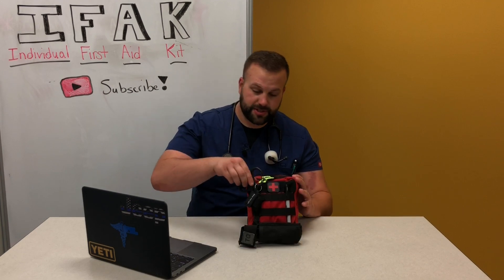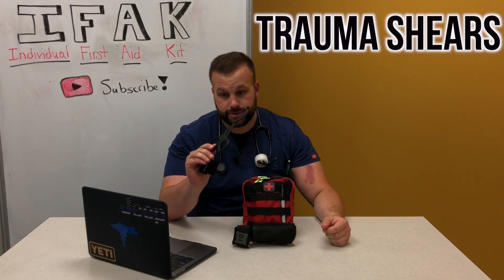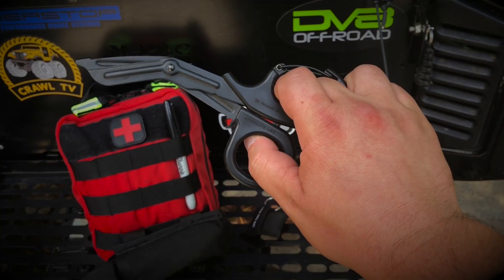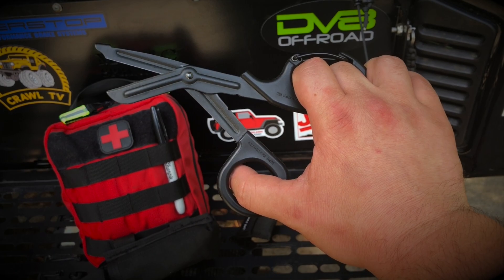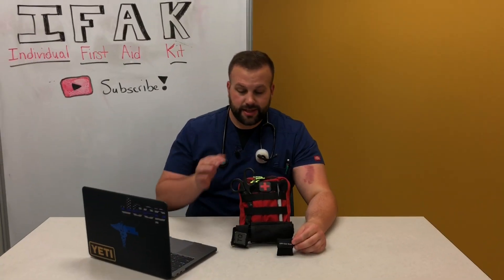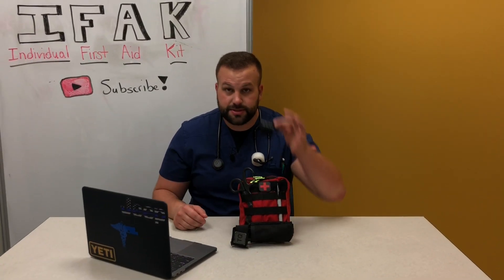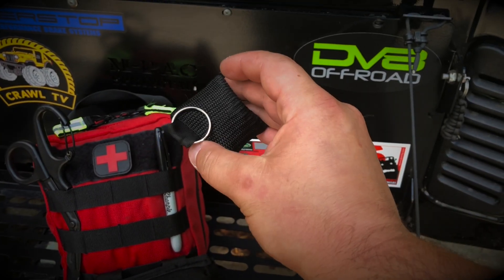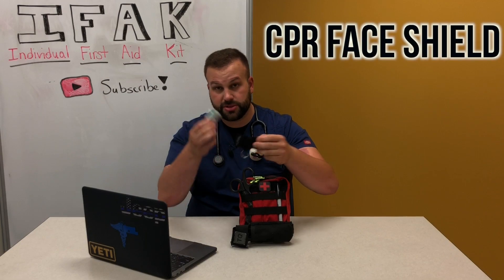The first item: a great pair of carabiner shears — very sharp, great size — with a carabiner clip that helps keep it in place whether on your pants or mounted somewhere else. Secondly, attached via carabiner clip for ease of access, a CPR face shield. I've got a couple of these — I carry a bigger one in my MFAK — but this one opens up for mouth-to-mouth resuscitation.